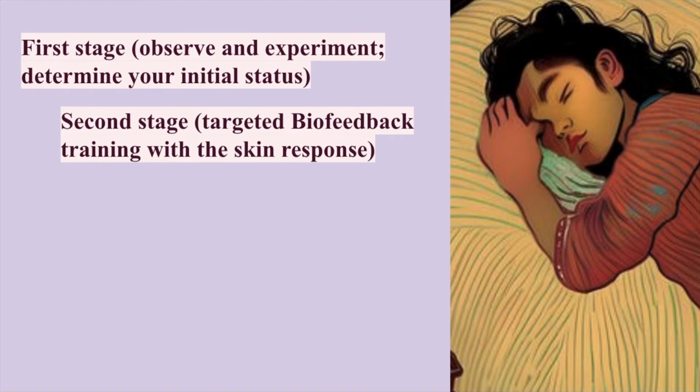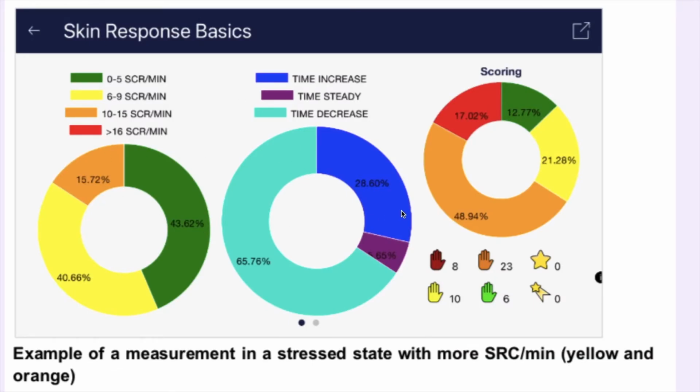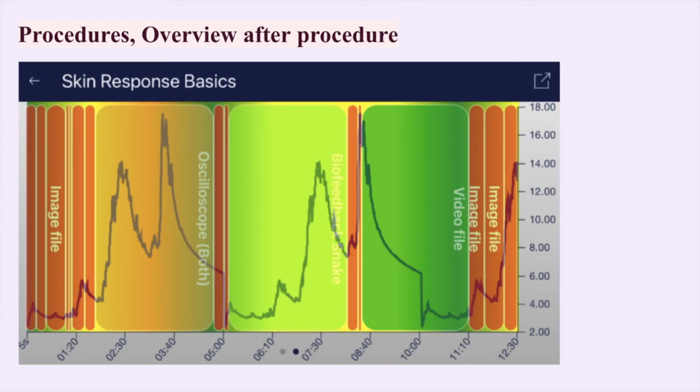After you complete the 10-minute baseline, you'll be shown a survey first, answering the questions and taking notes if necessary. It'll be asking you how you feel in general on a scale of 1 to 10. Then you'll see the pie charts, and that shows the fluctuations per minute. So this is what we would be seeing and what we would get inferences out of. So this is just your state at rest, and that's about it.